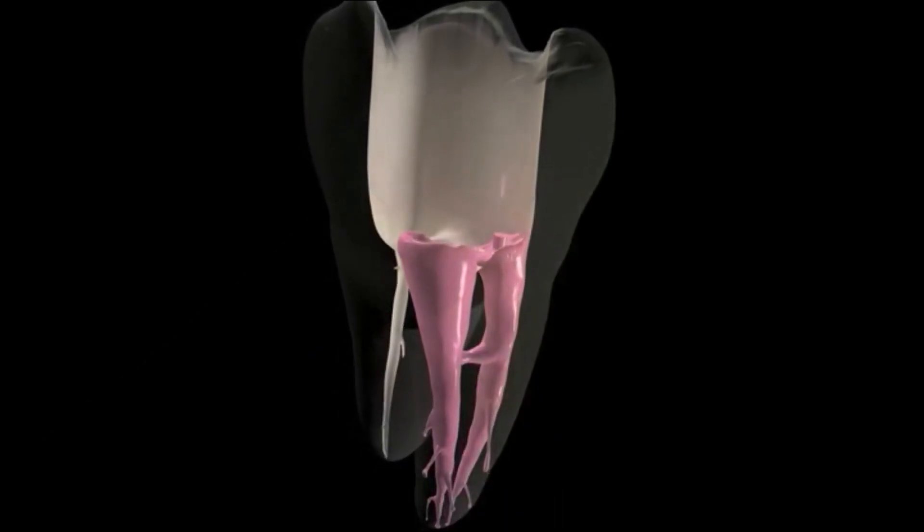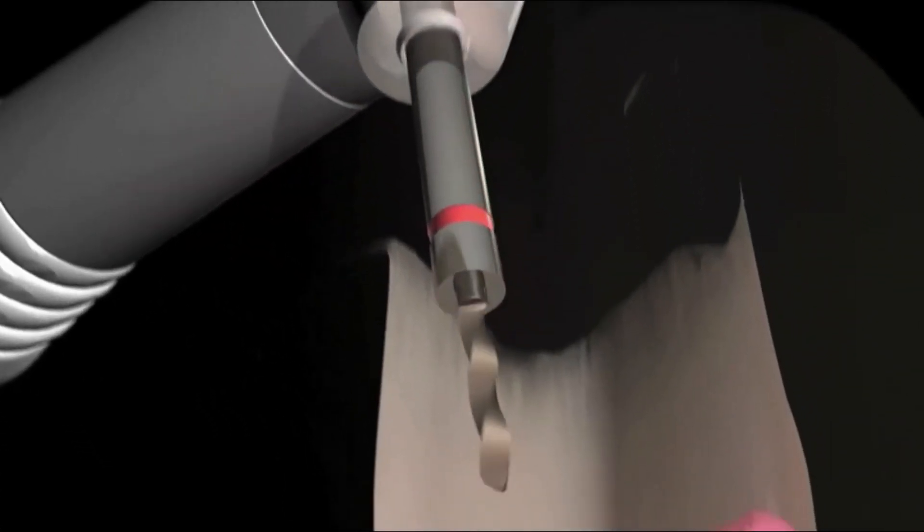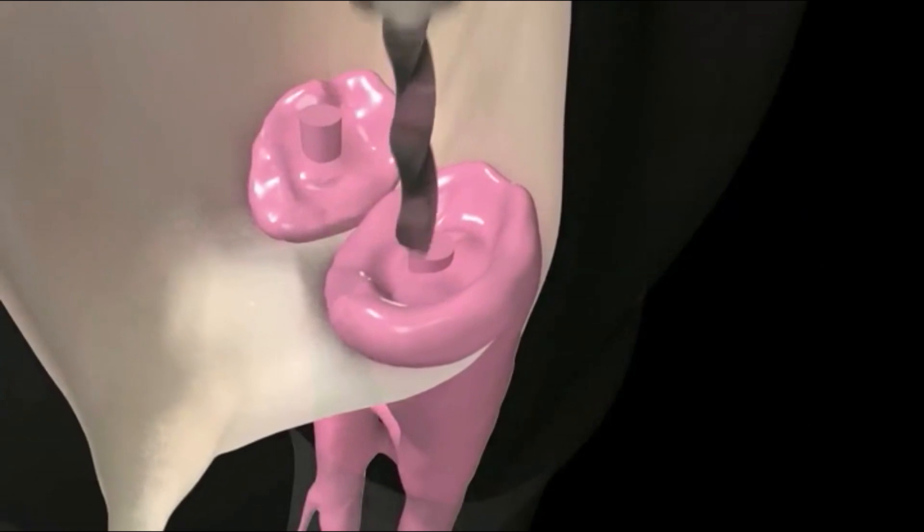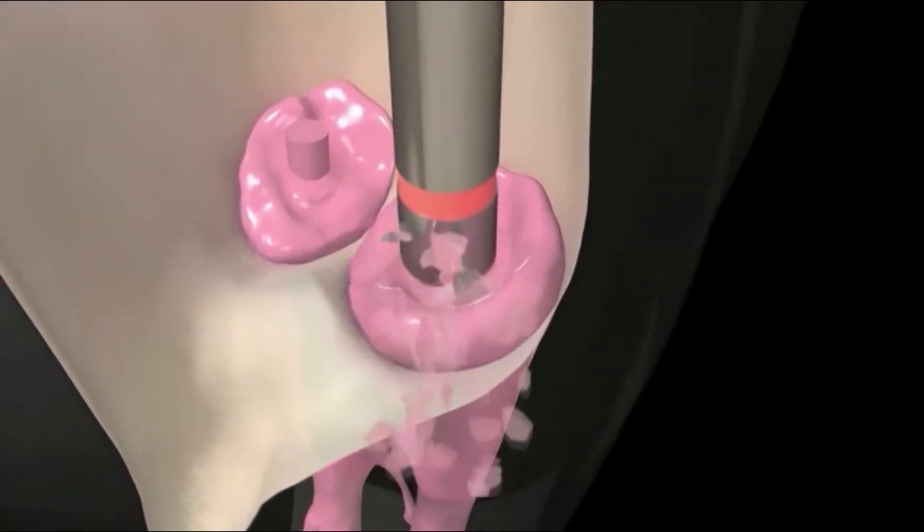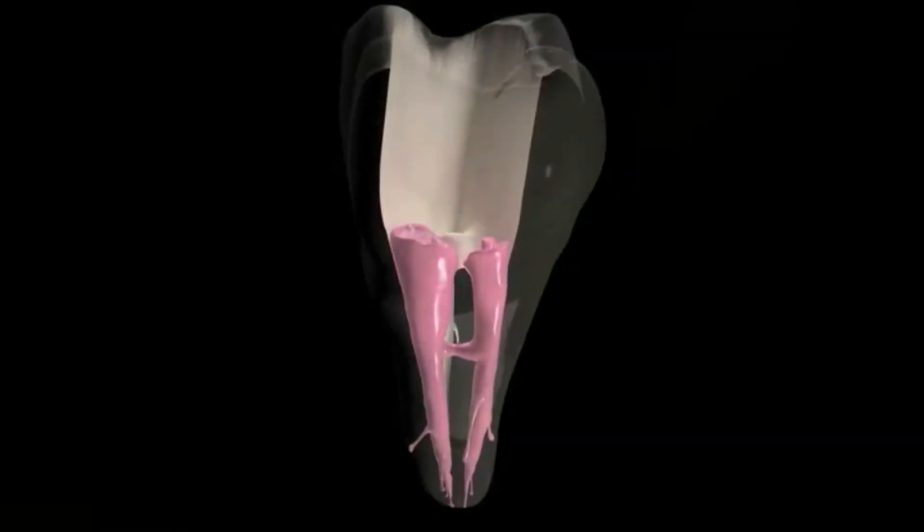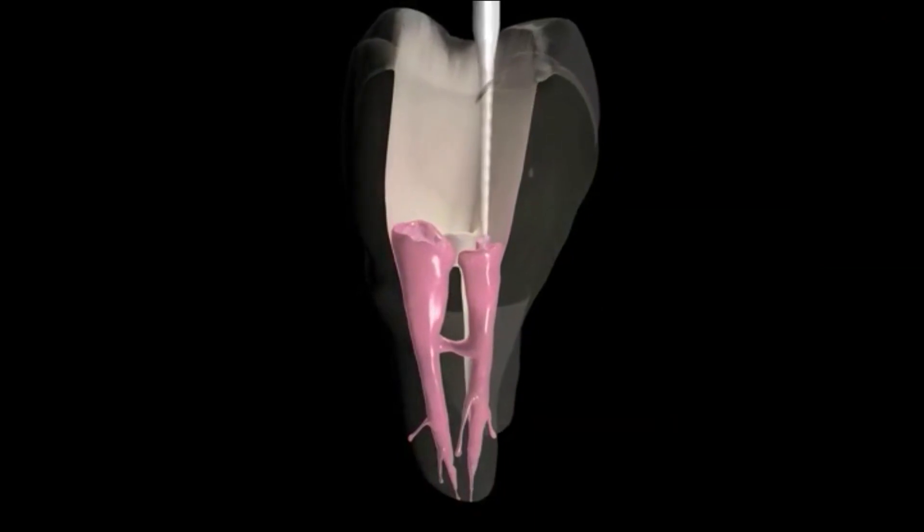GuttaCore obturators remove easily, like Gutta-percha, because they are Gutta-percha through and through. You'll see the familiar shredding characteristic, whether you're creating post-space or retreating.